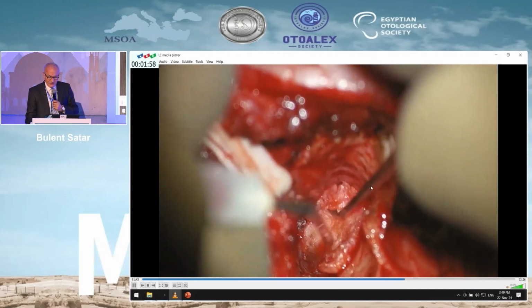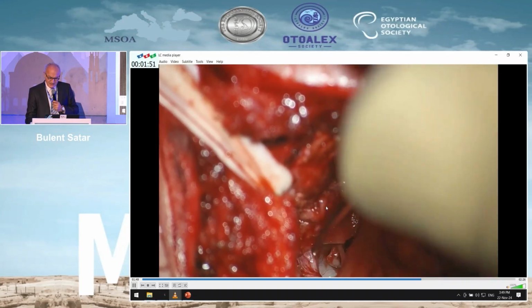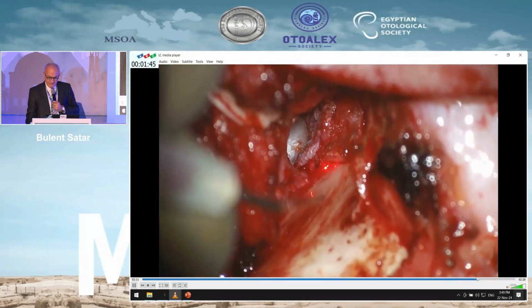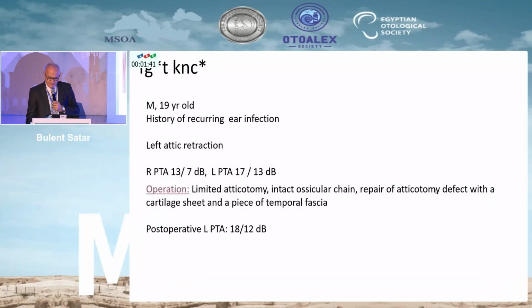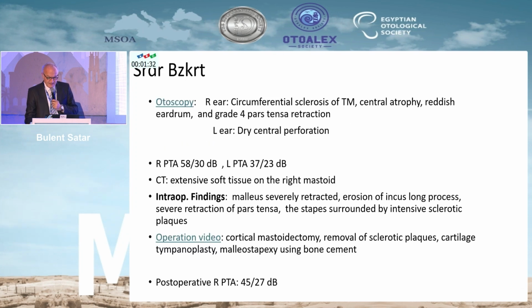I completely closed that area and I placed the fascia over the cartilage sheet. Postoperatively, he didn't have any change in hearing.